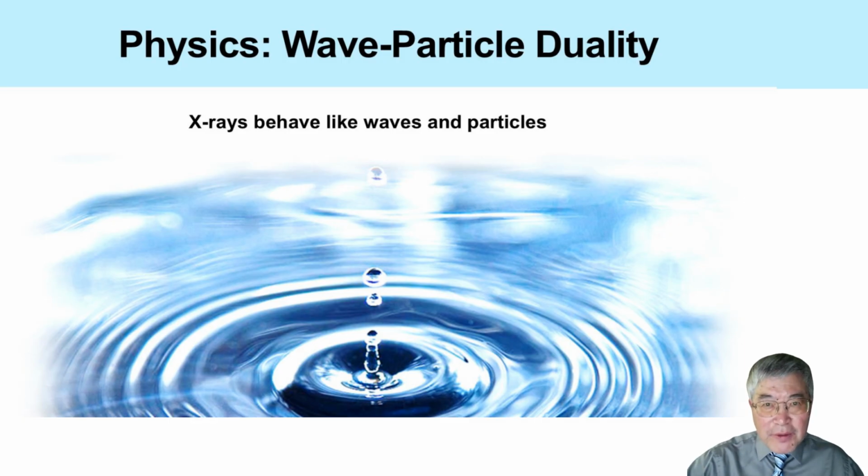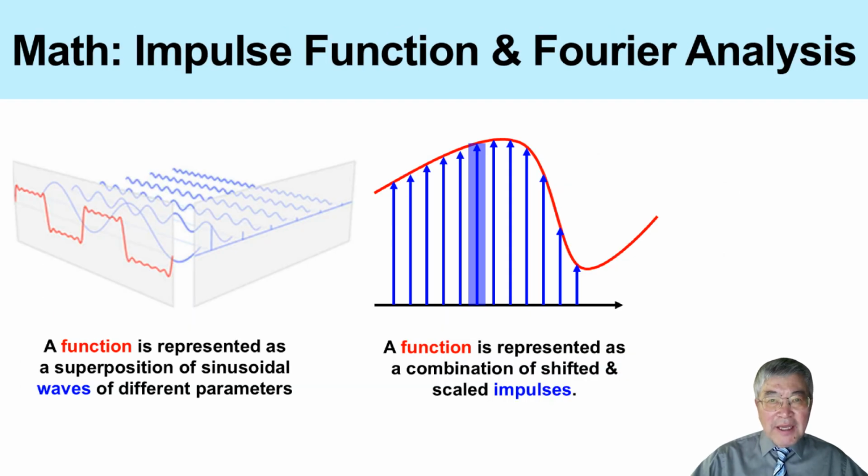You may have heard of wave-particle duality in physics. In a similar spirit, we will begin with a kind of duality in mathematics and signal processing. This perspective will help us connect geometric intuition with analytical reconstruction formulas. Once we see that connection, the reconstruction theory will become much less mysterious. The duality is not only a concept in the physical world. We also have duality in mathematical signal processing.